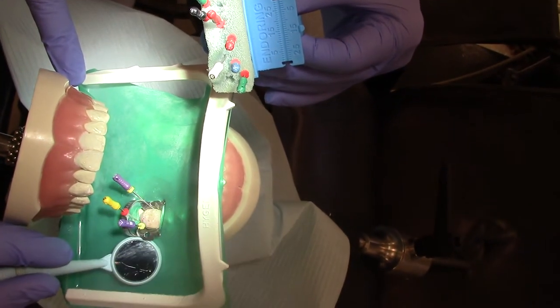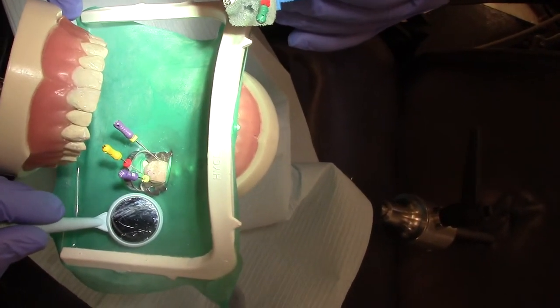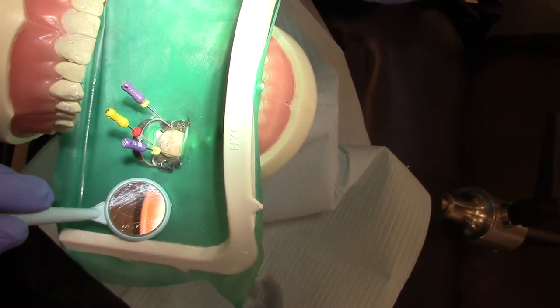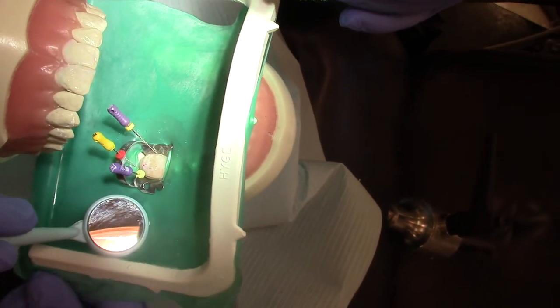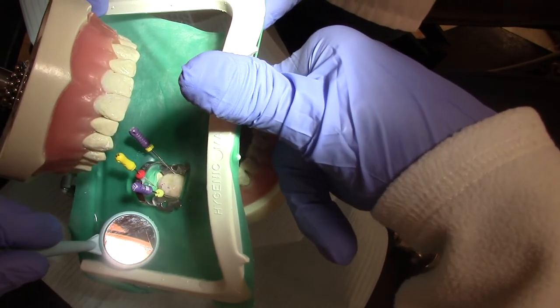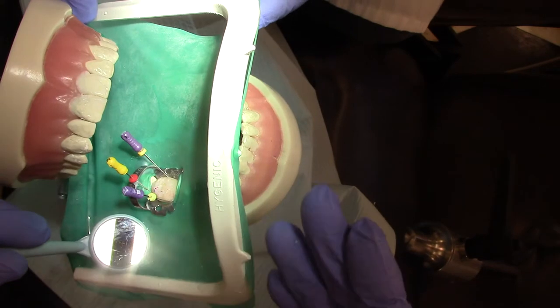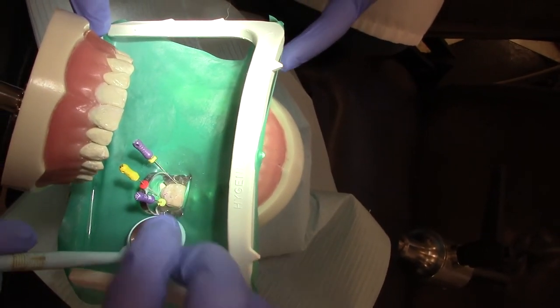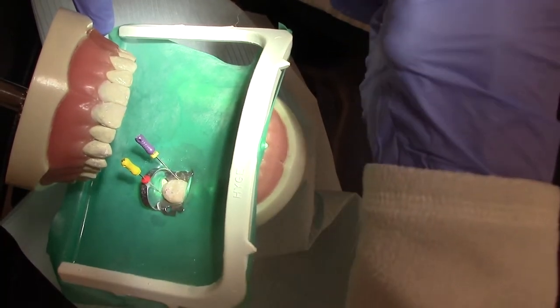Right now we have three files in our tooth, and this would be the time that we would take our x-ray. For our first x-ray we would take off our frame, put our sensor underneath, and take the x-ray. Now we have our working lengths.